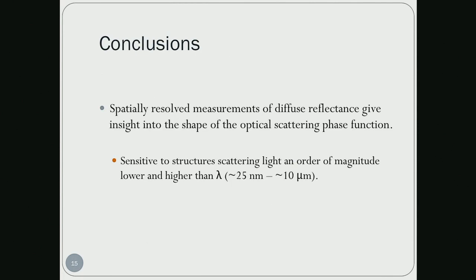In conclusion, this probe obviously has a very simple design, but that's really our goal: to make something that's really targeted at what we want and very powerful. It's very powerful in what we want to do, which is detect these very small structures. As I've shown, its sensitivity ranges to about an order of magnitude lower and higher than the wavelength of light.